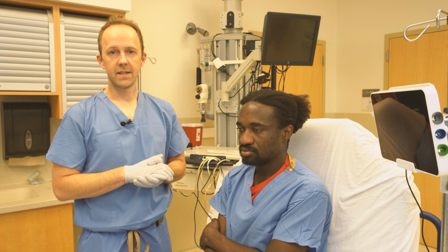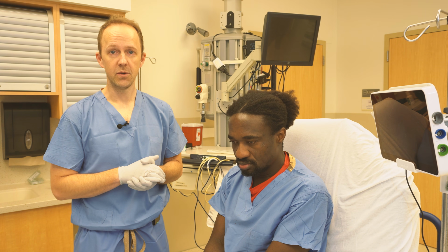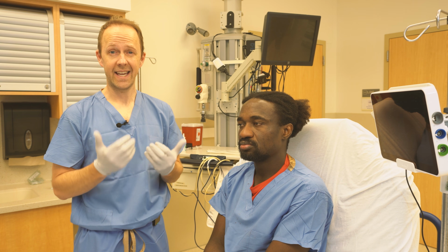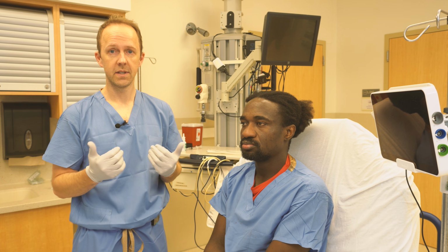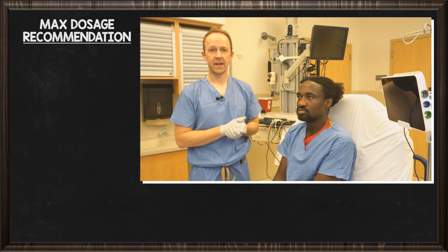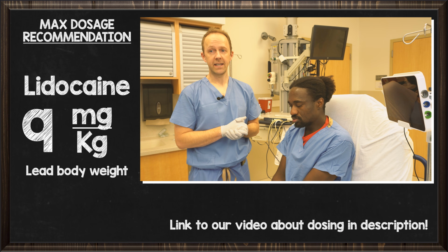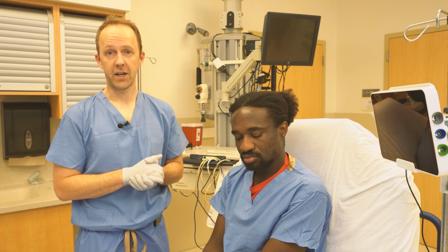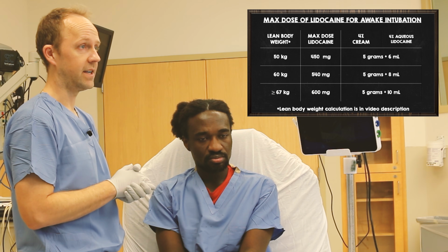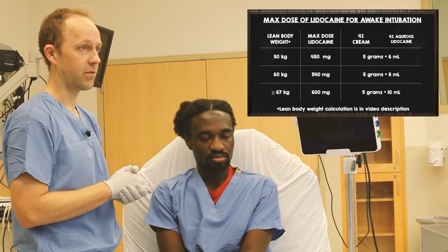One of the most important considerations when doing topical anesthesia is using the appropriate dose. You want to be meticulous and generous with your topical anesthesia to get both the nose and the back of the throat. And the Difficult Airway Society recommends a maximum dose of 9 milligrams per kilogram of lidocaine. This equates to about 15 grams or mLs of 4% lidocaine that you can give to your patients as long as they weigh more than 67 kilos. That's usually more than enough to anesthetize the nose and the back of the throat.